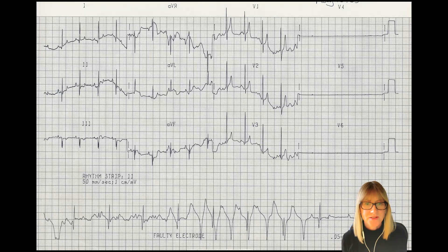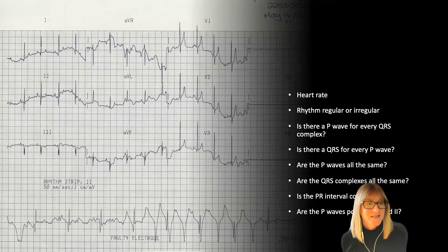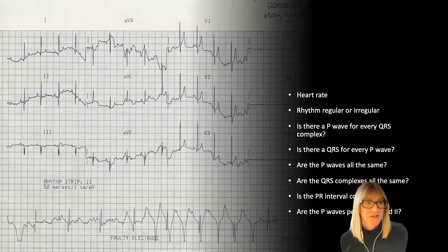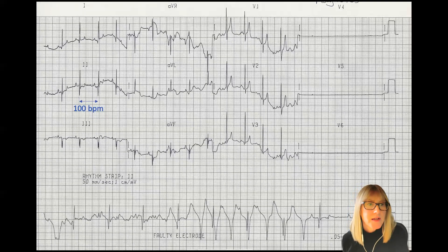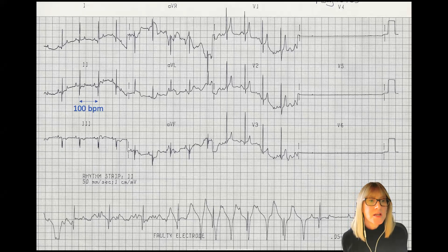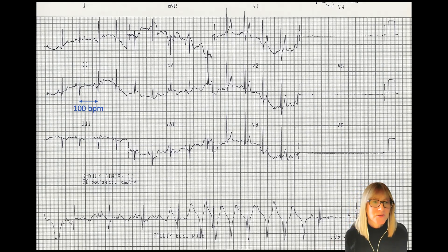Looking at our common questions — heart rate, rhythm, and whether all of our normal waveforms are present — let's run through these on the top three lines. Heart rate at 25 millimeters per second: using my 300 rule, since my instantaneous heartbeats are about three large boxes apart, I know my heart rate is 100. Remember: 300, 150, 100 is the rule.